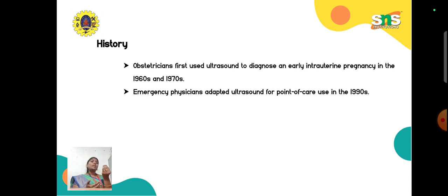It is very risky and has to be identified at an early stage, otherwise it will burst the fallopian tube, which is very dangerous to the female. Such findings can easily be obtained by ultrasound. This is where the role of ultrasound started to boom in the field of obstetrics and gynecology.